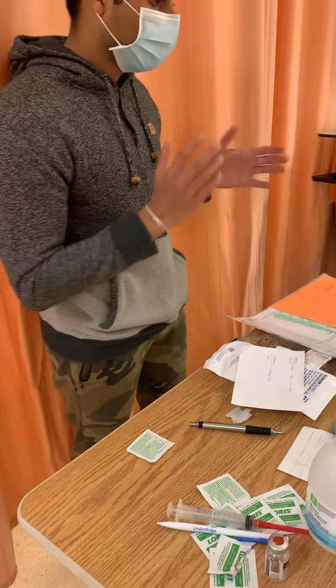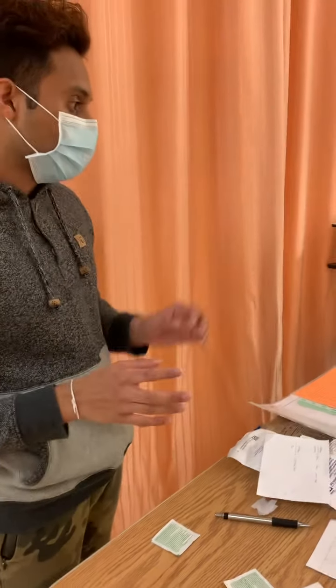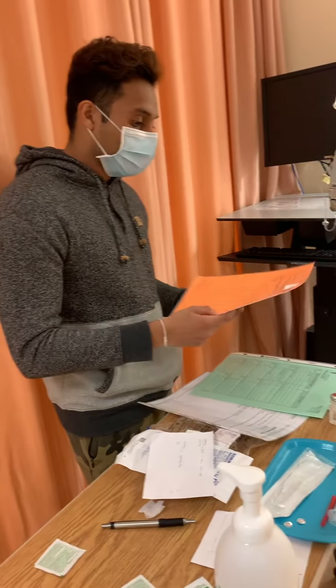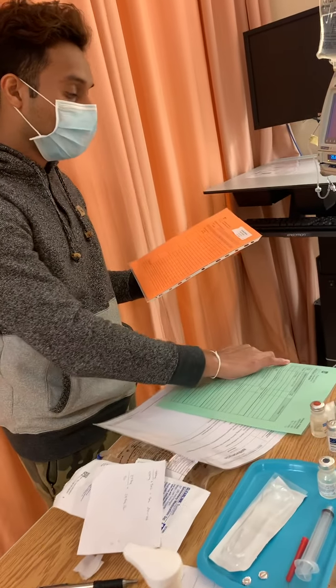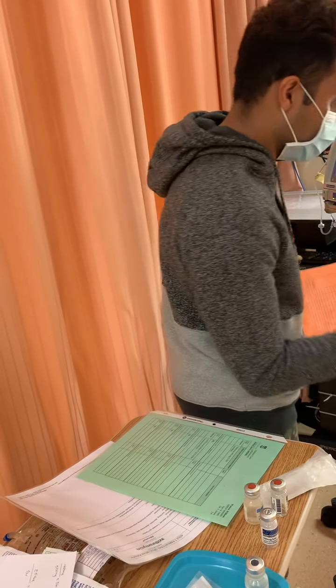So we're just gonna head to the bedside, do a quick safety check, see there's no tripping hazard or anything, call bell is within reach, bed is in low position, patient is settled. So wash your hands, enter in, and introduce yourself. So hi, my name is Isal Perera, I'm a student nurse in Manitoba. We're gonna give you some medication. Can I just check your armband to see the medication? So we're checking the armband here.